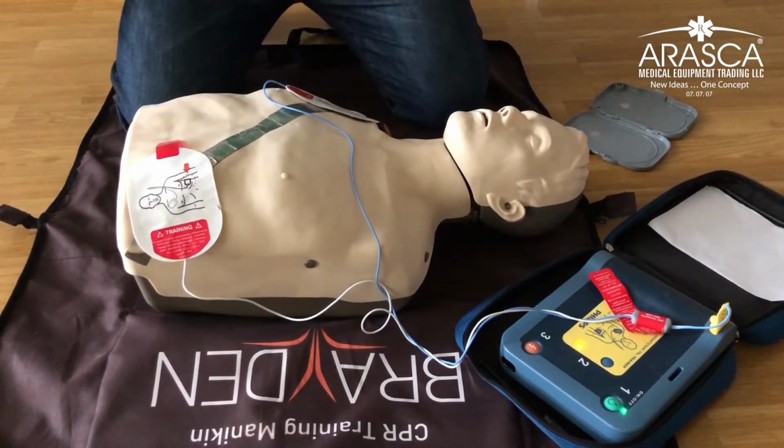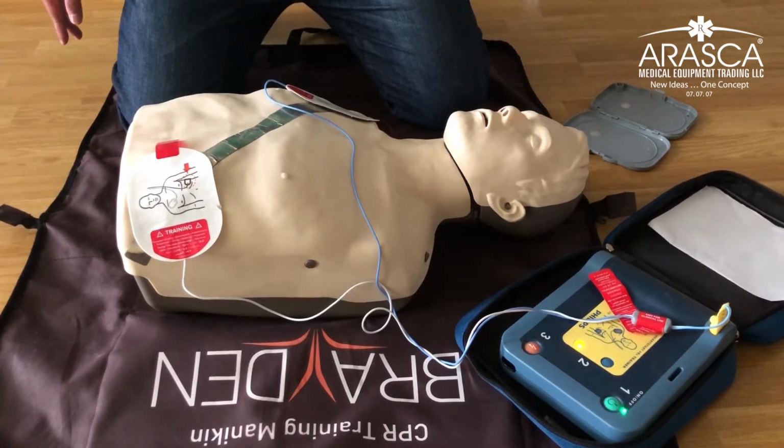Stay clear of patient. Analyzing heart rhythm. Shock advised. Stay clear of patient.